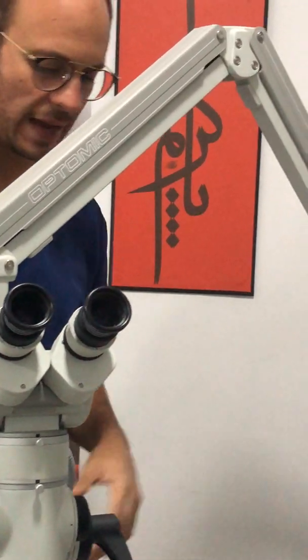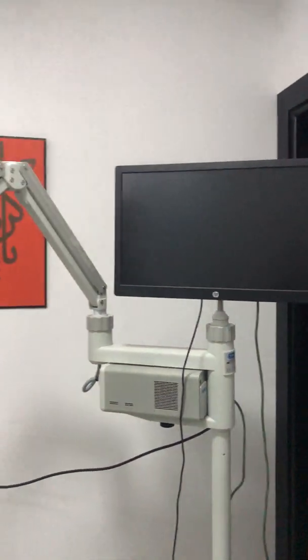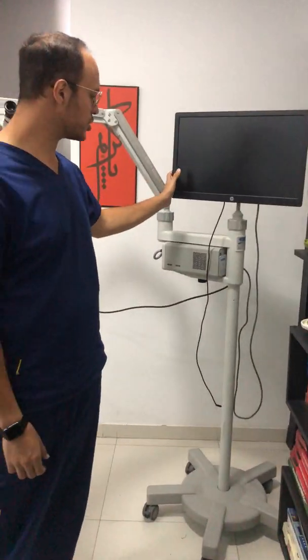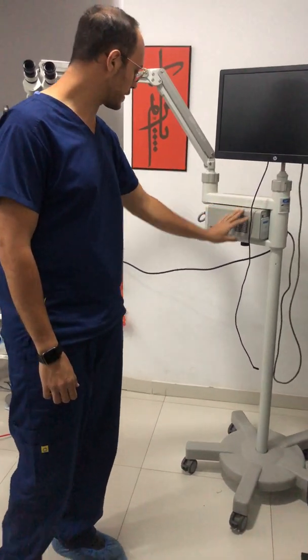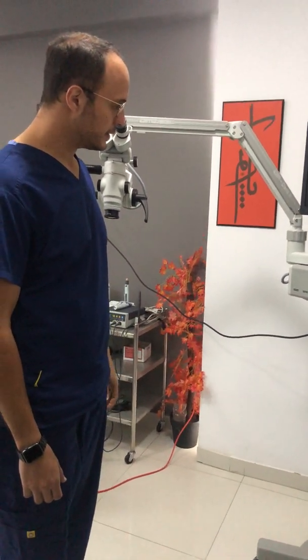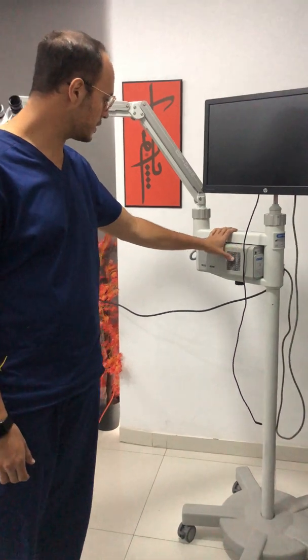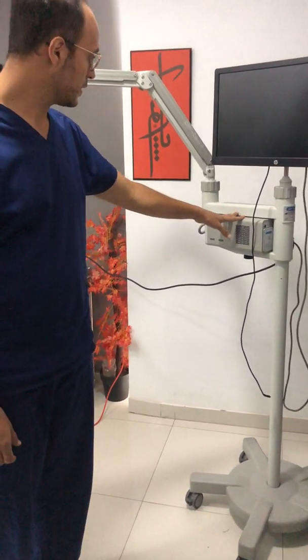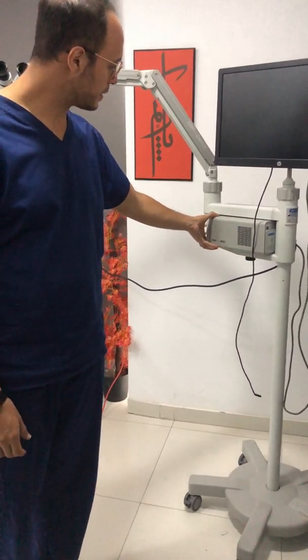It has some positive and negative aspects. First, the body itself is built with a built-in screen, which I think is not a very good idea because the screen keeps tangling with the rest of the equipment we have in the clinic. However, it's a good advantage if you don't have a screen built into your clinic to attach your microscopes to.